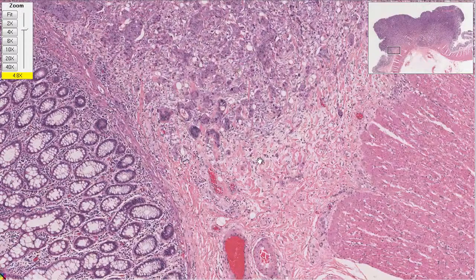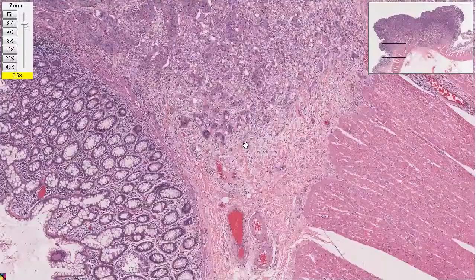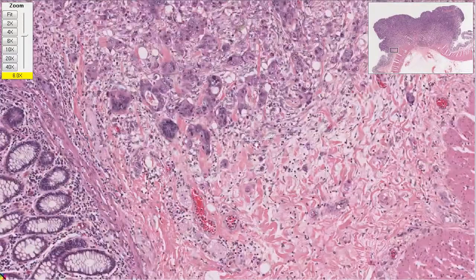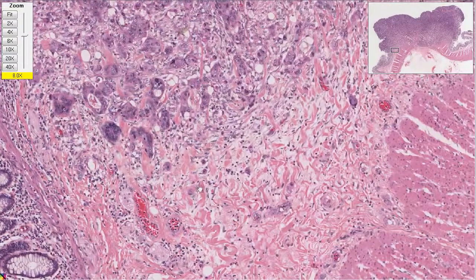And so there you'd say, well, if it's the tip of the polyp and it looks like this, I think we got it out. But you'd say to yourself, we'd better watch this person. So if the whole polyp looked like that, you'd cut out a bigger section. Yeah, then you might. So if it's going down into the neck or getting a little further, or if you cut across it at the margin, then watch out.